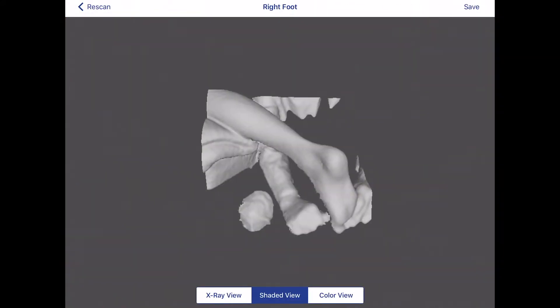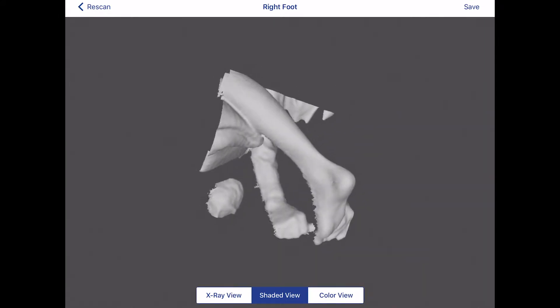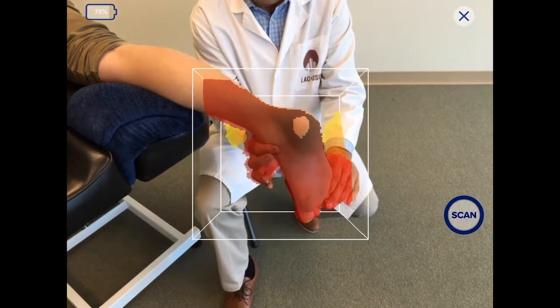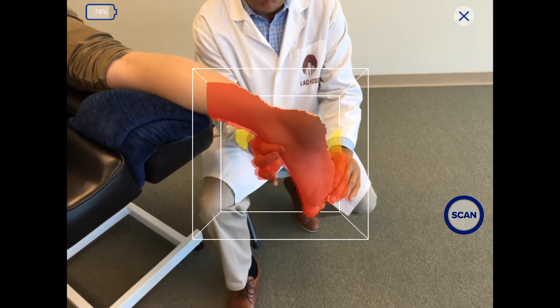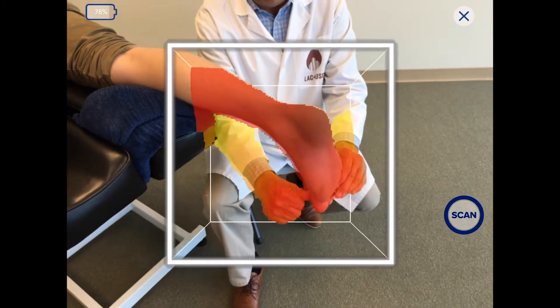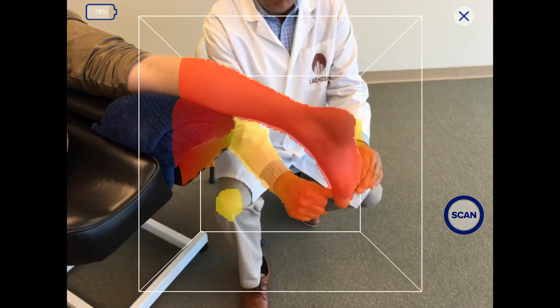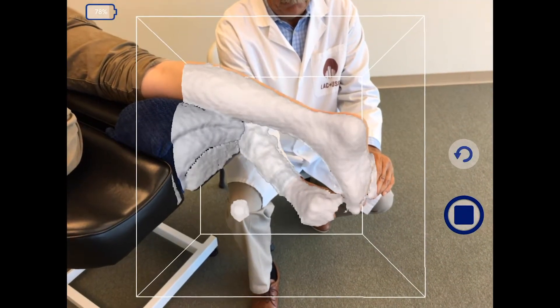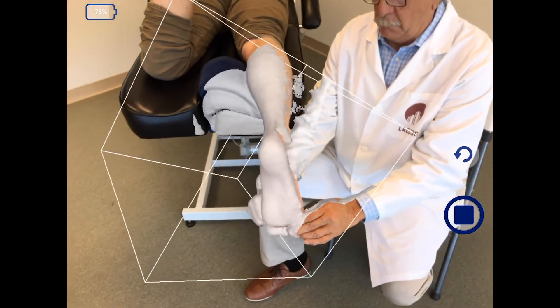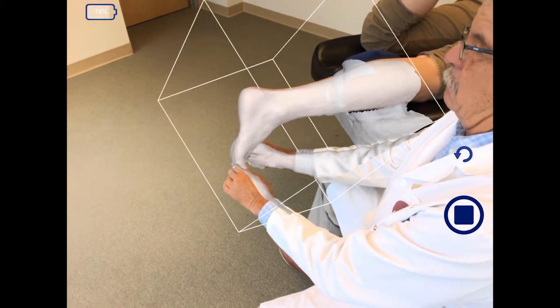Then review the digital cast for completeness and accuracy. Let's review one more time. The foot must be positioned properly in subtalar neutral with the mid-tarsal joint loaded. The cube is sized around the required anatomy, keeping the color outline according to the height of the brace you are prescribing. Move slowly around the foot as though you were taking a video of the anatomy, and the application paints all of the anatomy white.